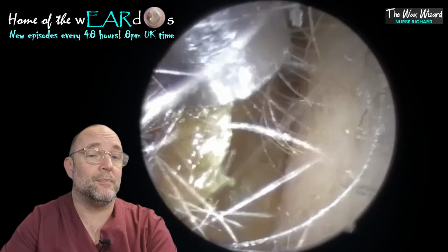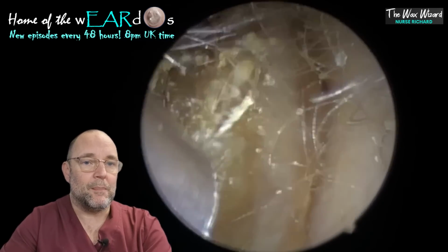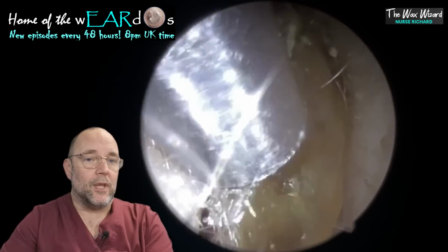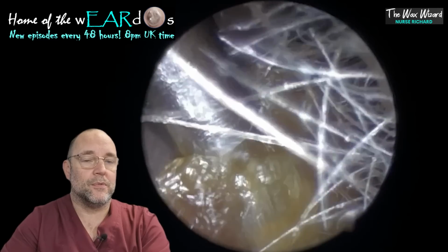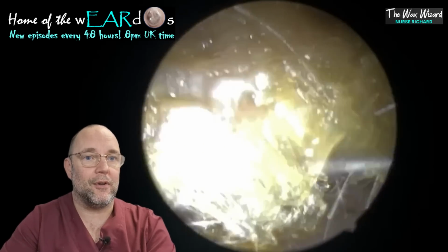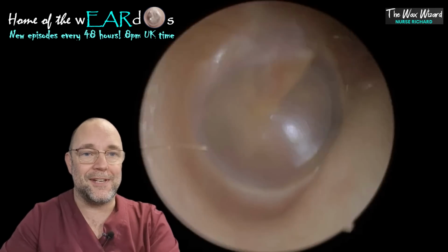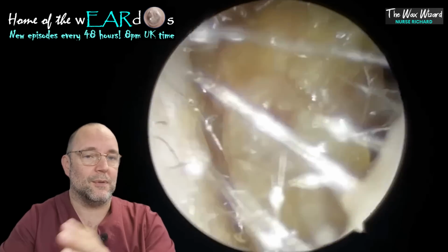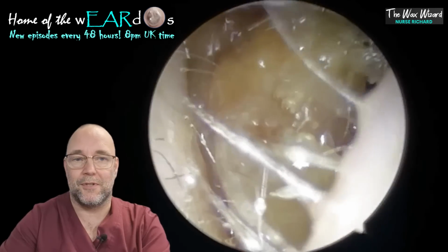You do get to see it does become a bit clearer, obviously after these have come. But the first one there, the first wax baby safely delivered, pops out without too much of an argument. Less magnified, which it might be. There she comes. Slowed it down again, if you can tell. So if you can hear my voice in the background, or the gentleman's voice, it might start going a bit lower and sounding a bit odd. But yeah, I think you appreciate it coming out a bit slower, so that's what I do every now and then. If I've whipped it out too fast, which I sometimes do.